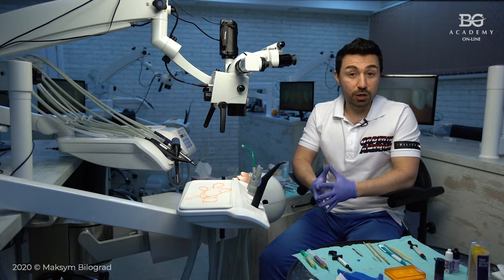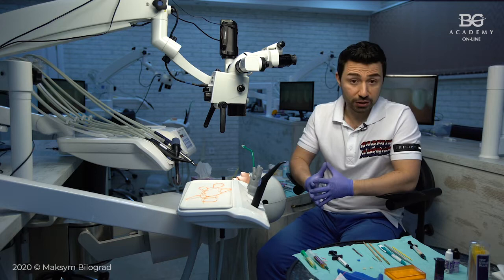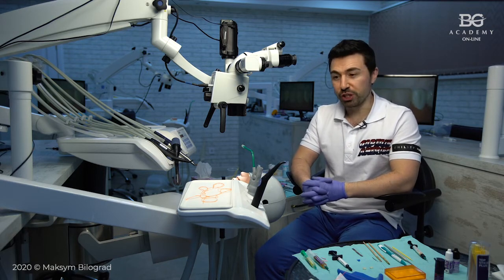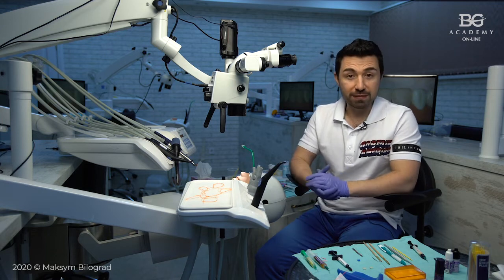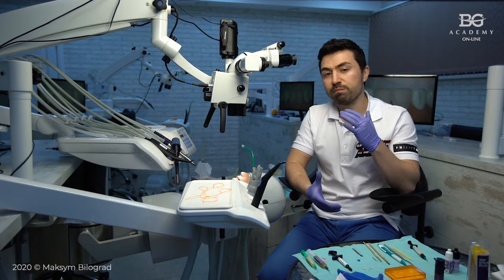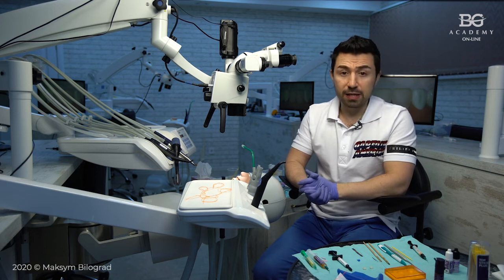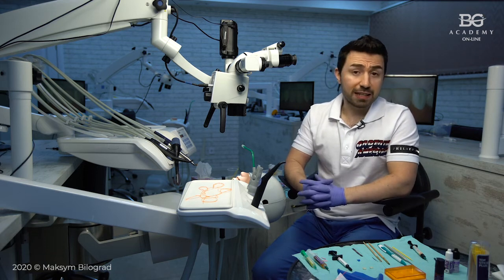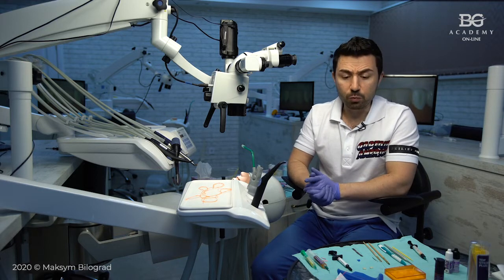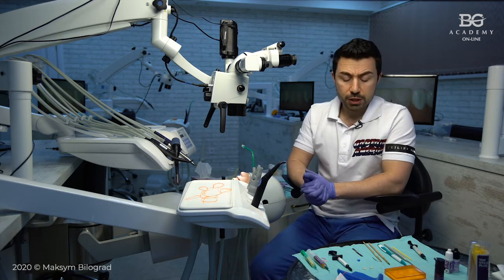This time we will be doing an online masterclass dedicated to porcelain veneer bonding, and I will be showing you step-by-step clinical procedures of ceramic veneer cementation with isolation, following all these protocols to make a really clear and systematized understanding of the whole clinical procedure. This online webinar will be, as I told you, dedicated to bonding procedures.